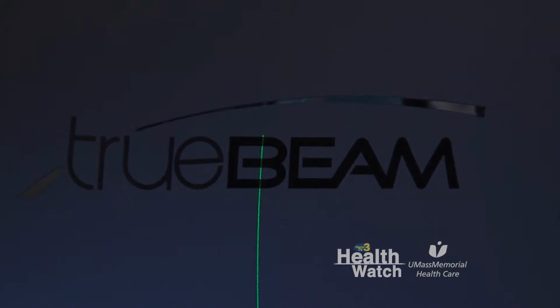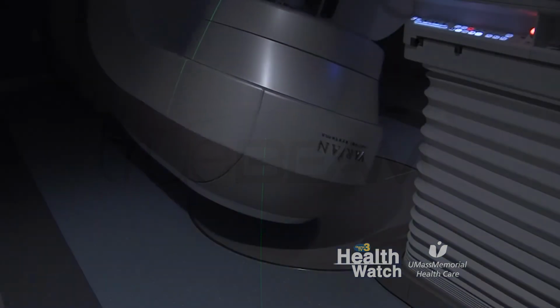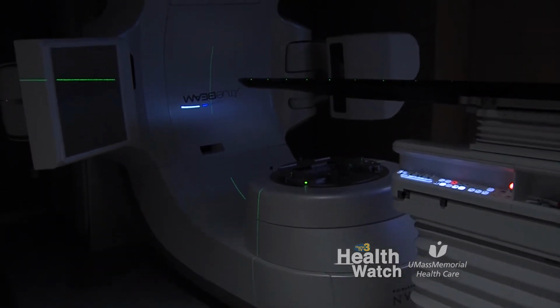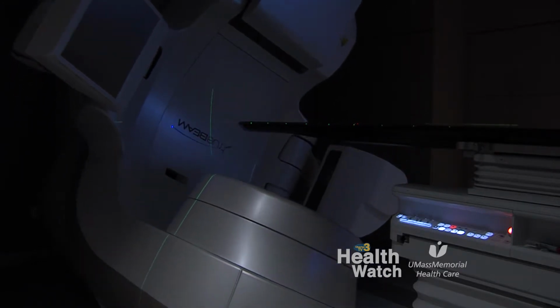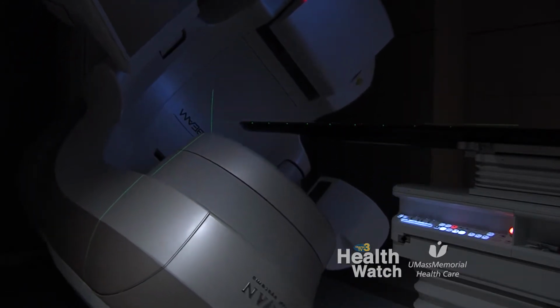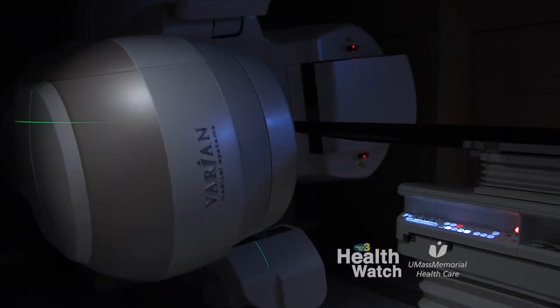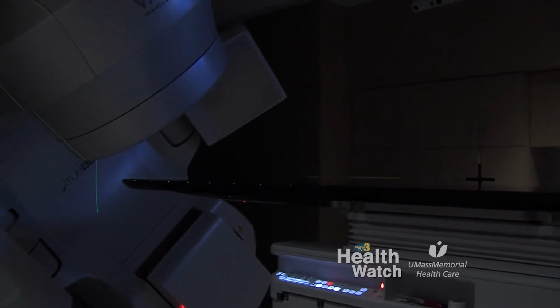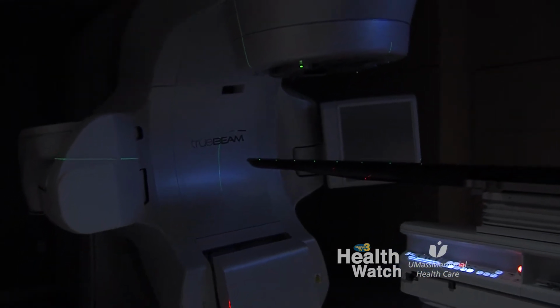The procedure is actually very elegant because the patient will come and we will build a device that secures their position. And then we perform four-dimensional modeling, which essentially monitors internal motion. Once we've established the dynamics of motion, we can then secure the target localization for treatment with CAT scan built into the machine itself. And so we're able to treat people in a matter of minutes, whereas even 10 years ago, this would take most of a treatment day just to do one treatment. So we actually schedule radiosurgery procedures now within the span of a normal treatment time of 15 to 20 minutes.